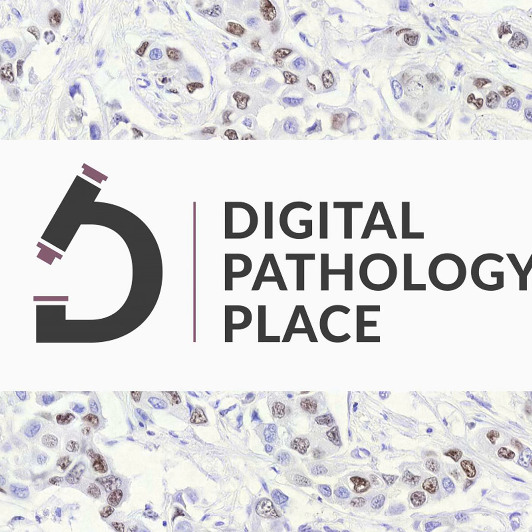Sure. There's actually quite a lot, but a limit to the number of antibodies that have been validated for doing multiplex, and even fewer that have been clinically validated. And so the panel would be, and again, it depends on the tissue or the disease state that you're looking in, the selection of biomarkers that you're going to be looking at on the tissue.